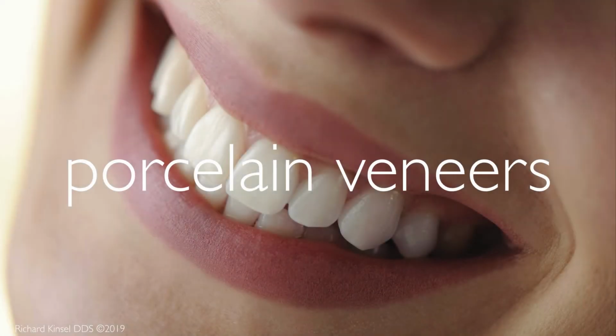Porcelain veneers are thin, durable ceramic facings that are directly bonded to the enamel of each tooth. Porcelain veneers can correct deficiencies of color, shape, length, and also close spaces.